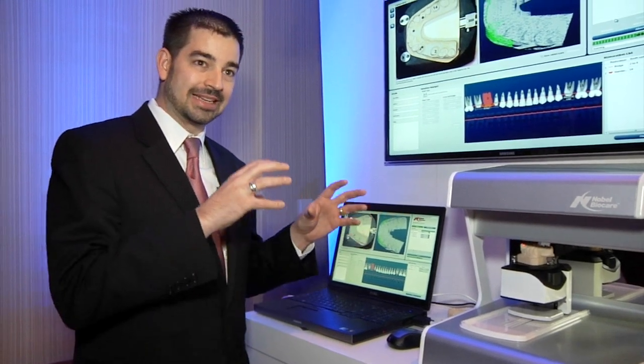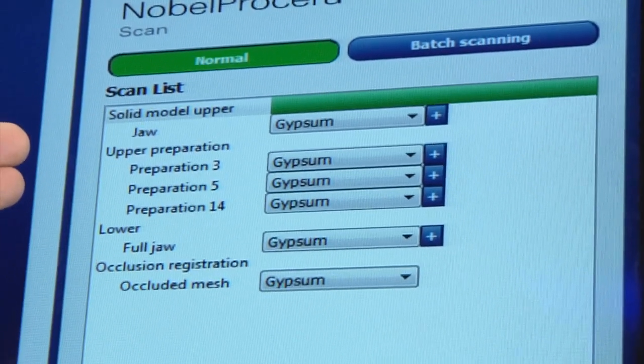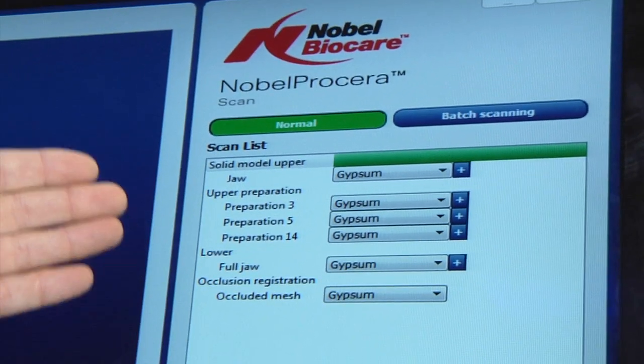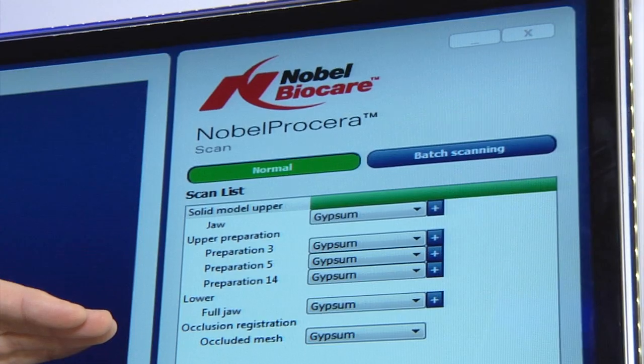In addition to the scanning technology, we've also invested quite a bit of time into software development for intuitiveness. We've made the software smarter to anticipate user interactions and therefore decrease the amount of user intervention needed with the system.